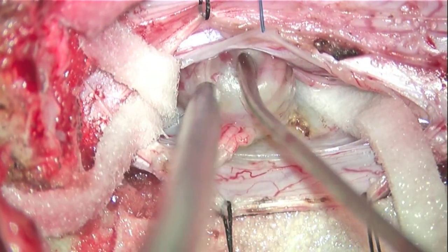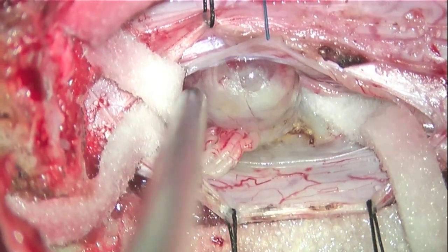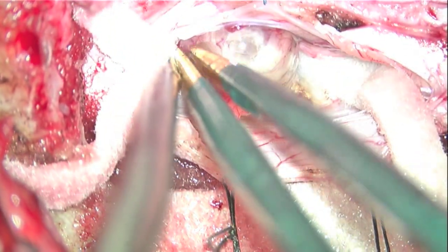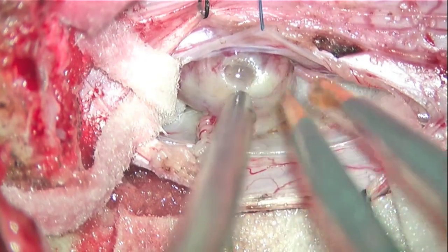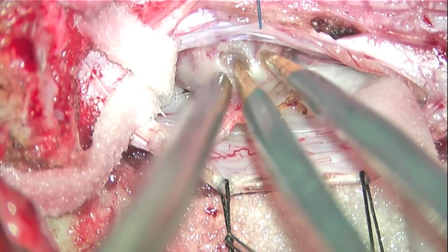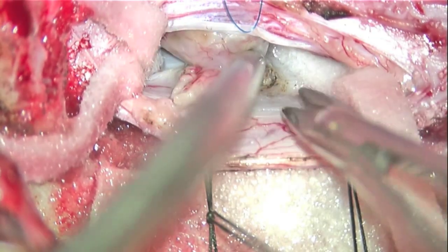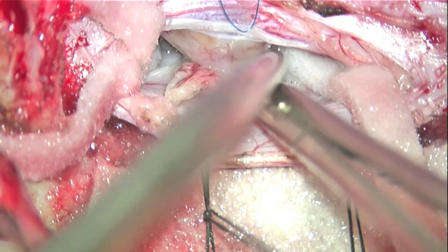There is usually a nice arachnoid plane that allows the tumor to be delivered laterally from the ventral cord surface. Irrigating cautery of the tumor surface both devascularizes and shrinks the tumor to aid in the dissection. Again, we continue to systematically work around the root sleeve exit to release the tumor's lateral intradural margin at the root sleeve.